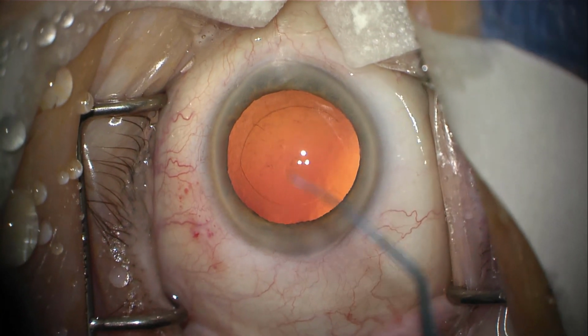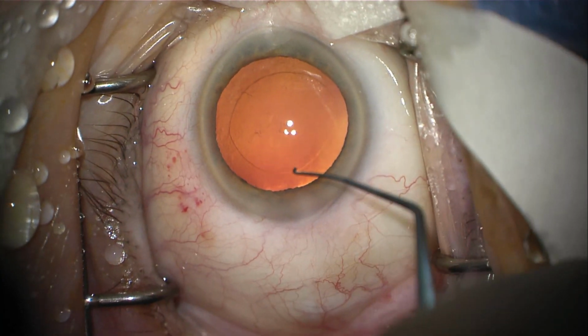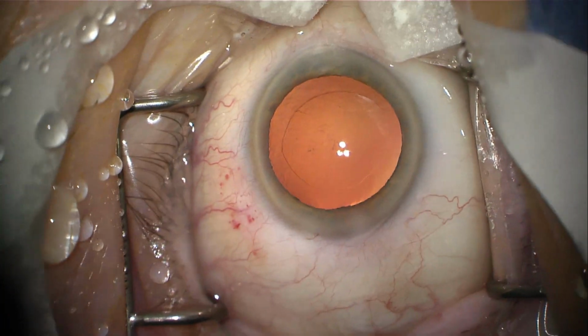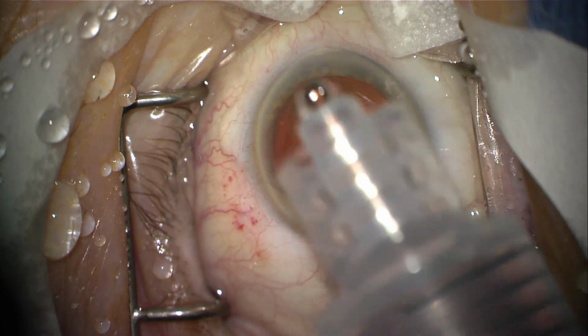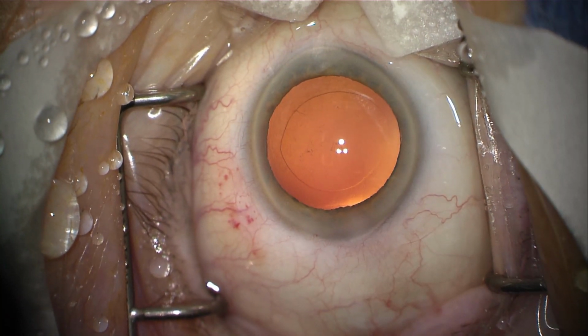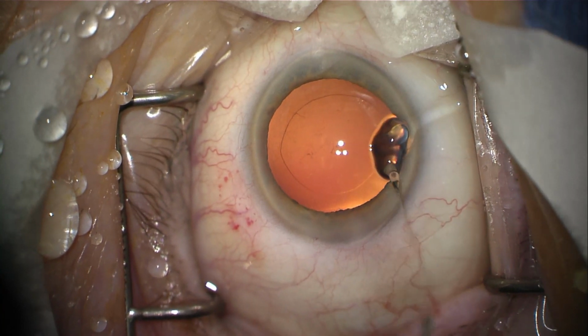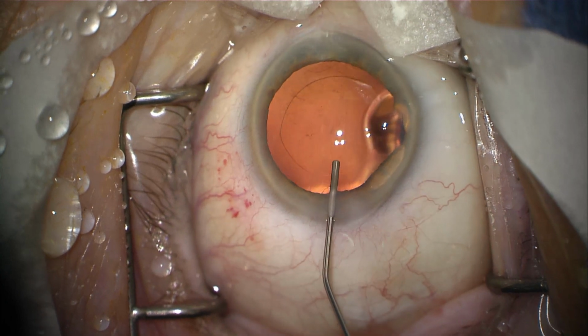So what do I do at this point? I want to delineate the anterior capsule with this hook. You can see it, it's almost a perfect circle there that I created in the beginning of the procedure. What I'm going to do now is basically inflate the eye with that gel-like substance. You can see it's like a thick gel. And I'm going to inject that in there to inflate the front part of the eye.